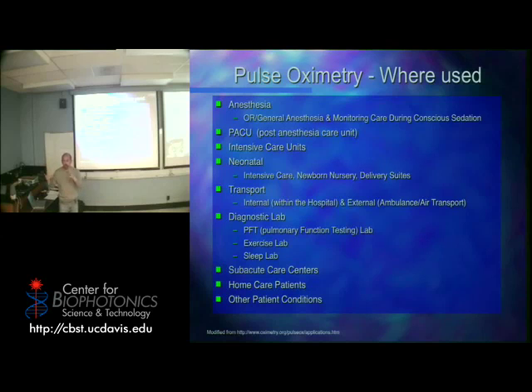It's also used when you bring a patient from one part of the hospital to the other. Right? In the diagnostic lab, where they're testing how well your lungs work. In the exercise lab, in the sleep lab. Sleep lab, they use it a lot to look for things like sleep apnea, where you're not getting enough oxygen, okay, and you're disrupting your breathing. Subacute care centers, home care patients, other patient conditions, and it's also used a ton by pilots.